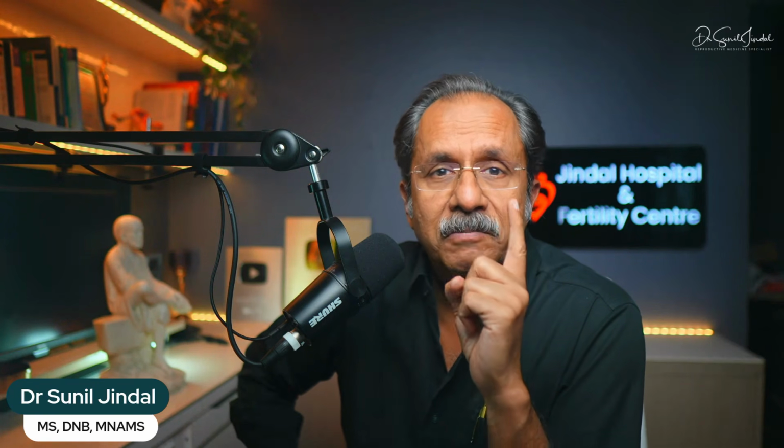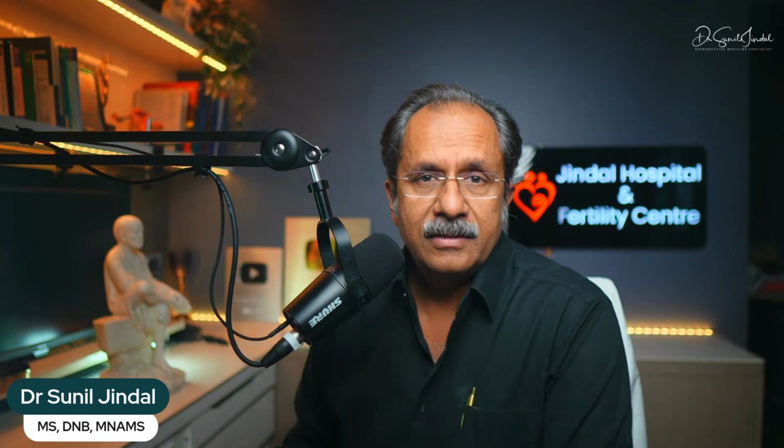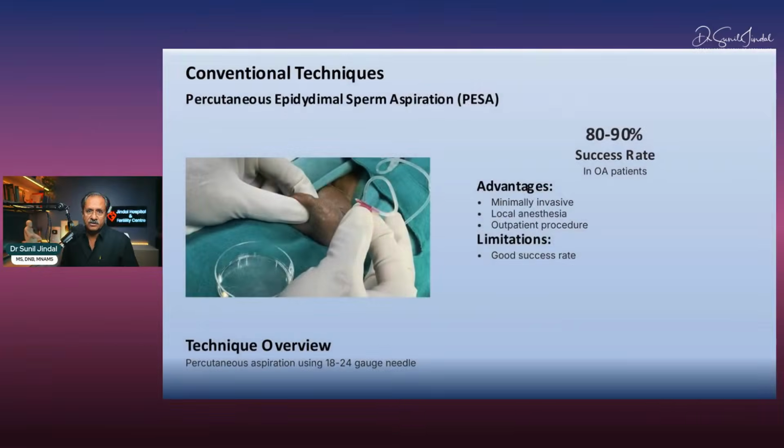So what we normally do is a microsurgical epididymal sperm aspiration, MESA. In MESA, we open up the epididymis, put a catheter into it, take a lot of material and freeze all these sperms apart from the sperm which we have taken up. So a MESA is better in terms of the number of sperms you can get because you are microsurgically opening up. But for this, general anesthesia has to be given. That is one area which is different.